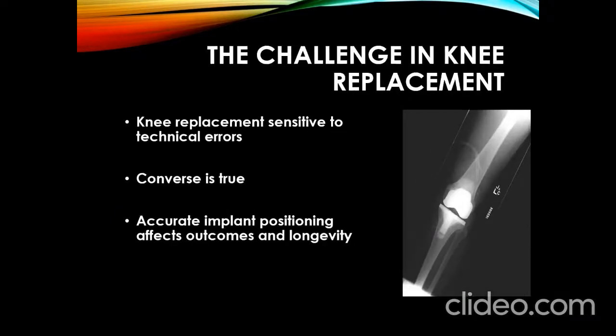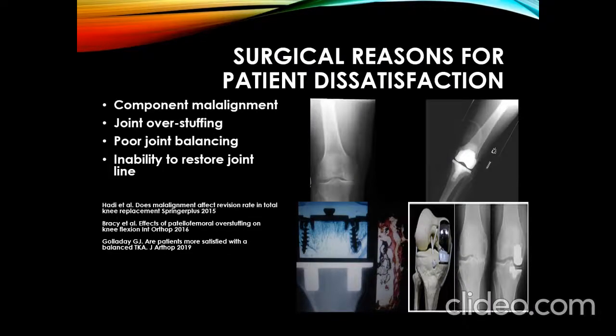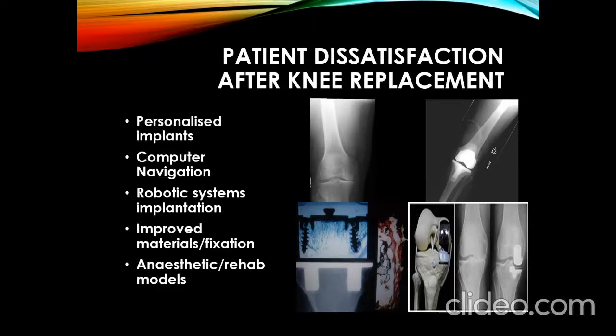We know that knee replacements are very sensitive to errors, and the converse is also true. So if we accurately and precisely position the knee replacement implant, we know patients do better. There are a lot of studies that have shown that if you get it wrong technically, you will have a poor outcome, and it is one of the reasons why patients are unhappy following knee replacement surgery. And it's this dissatisfaction and long recovery that is driving the various innovations in knee replacement surgery, from personalized implants to robot-assisted technology.